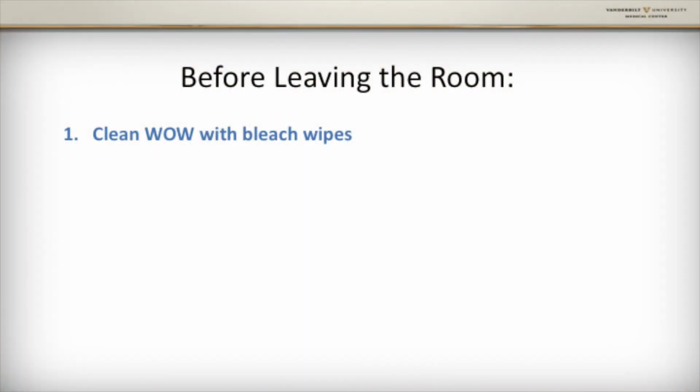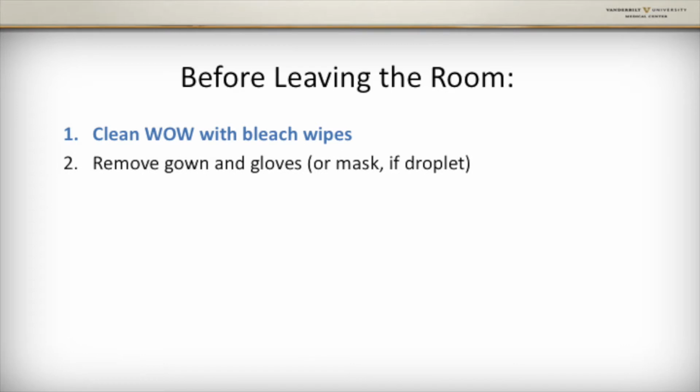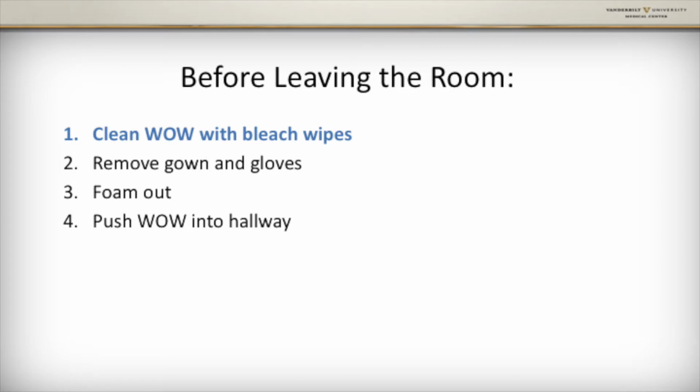Before leaving the room, you will need to clean the WOW with bleach wipes. You are able to safely clean all components of the WOW except for the monitor screen with the bleach wipes. You can then remove your gown and gloves, foam out, and then push the WOW into the hallway.